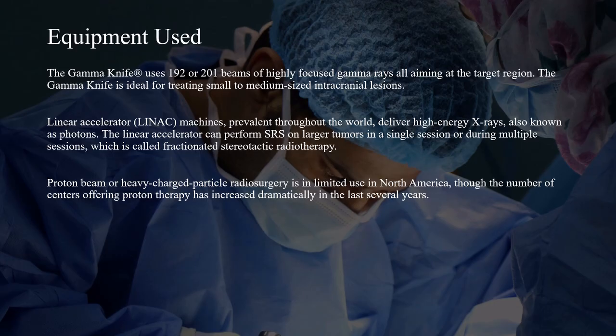The Gamma knife uses 192 or 201 beams of highly focused gamma rays, all aiming at the target region. The Gamma knife is ideal for treating small to medium-sized intracranial lesions. Linear accelerator machines, prevalent throughout the world, deliver high-energy X-rays, also known as photons. The linear accelerator can perform SRS on larger tumors in a single session or during multiple sessions, which is called fractionated stereotactic radiotherapy. Proton beam or heavy charge particle radiosurgery is in limited use in North America, though the number of centers offering proton therapy has increased dramatically in the last several years.